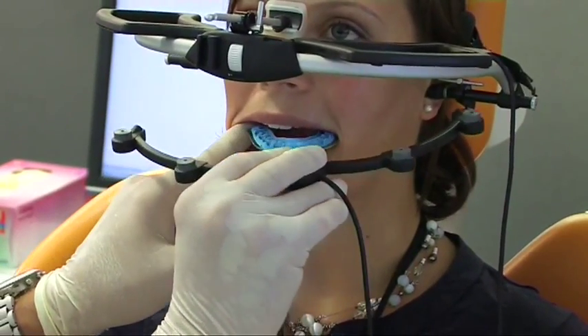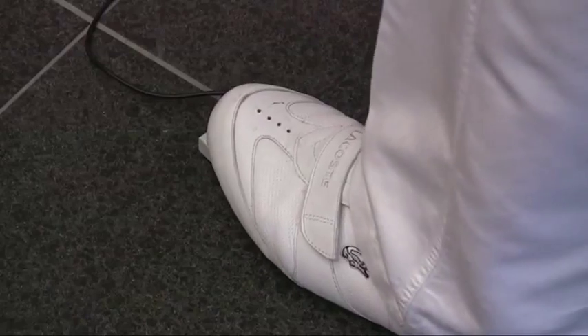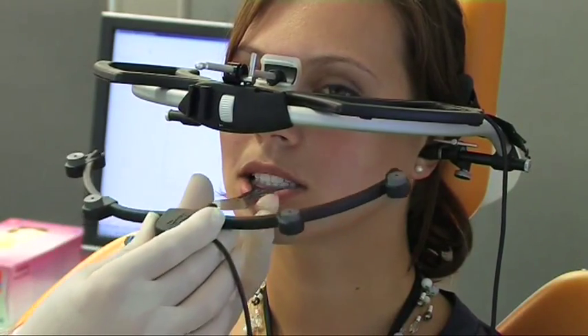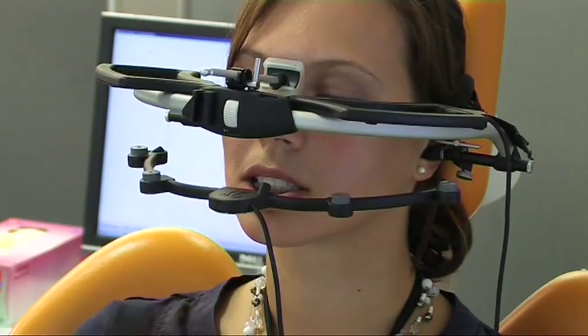Open please. The bite fork with the lower sensory bow is brought into position and the measurement is carried out. Then the bite fork is removed and the sensory bow is placed on the paraocclusal spoon.